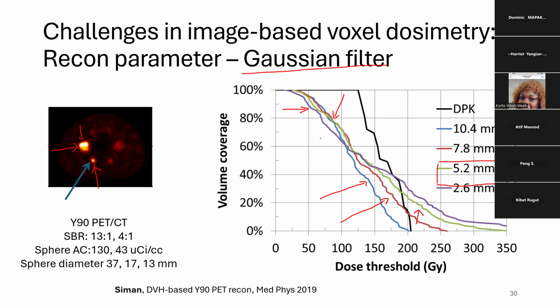And if you want to do dosimetry, then you have a separate reconstruction that's optimized for dosimetry. This is a retrospective reconstruction, right? So you do not have to say, I just want it for dosimetry, so I cannot use it for visualization. That is not the case. All you need to do is create another set of reconstructions that allow you to better visualize it.